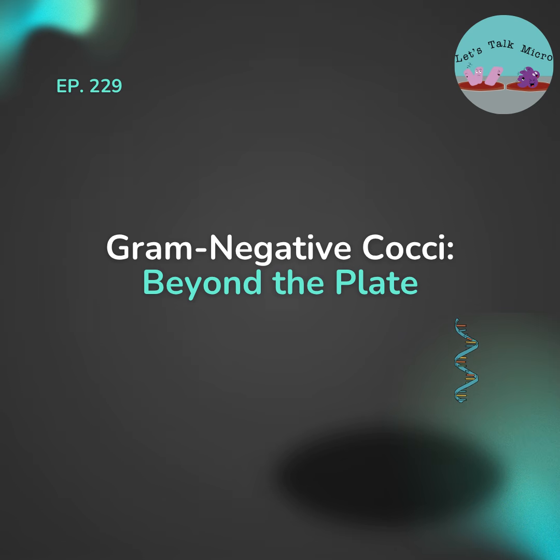So I invite you to check out episodes 112 and 115 to learn more about MALDI-TOF MS. And in a nutshell, right, you have a slide, you put your sample there, you add a substance, and then a laser is pointed at the sample. And then that substance is going to ionize the molecules. And then the molecules travel through a tube, and the time of flight is measured, and then a spectrum is produced, and that is compared to a database of known spectra, and you get an ID.